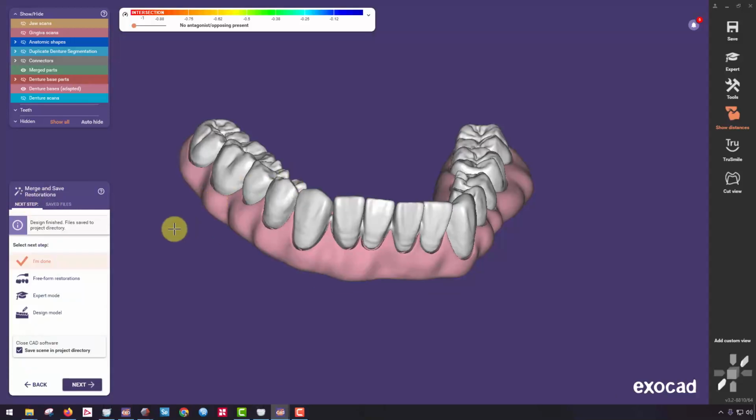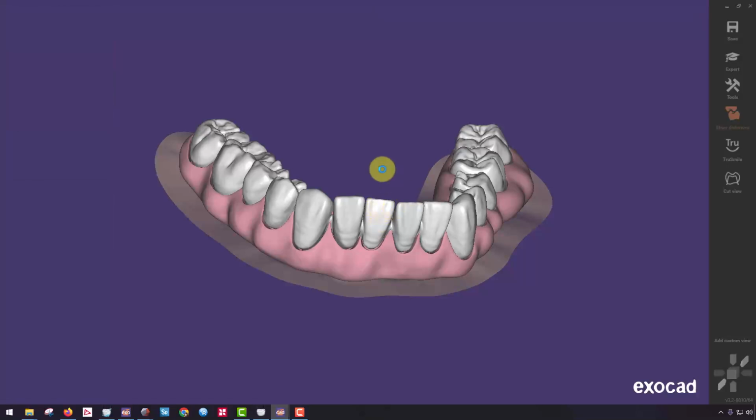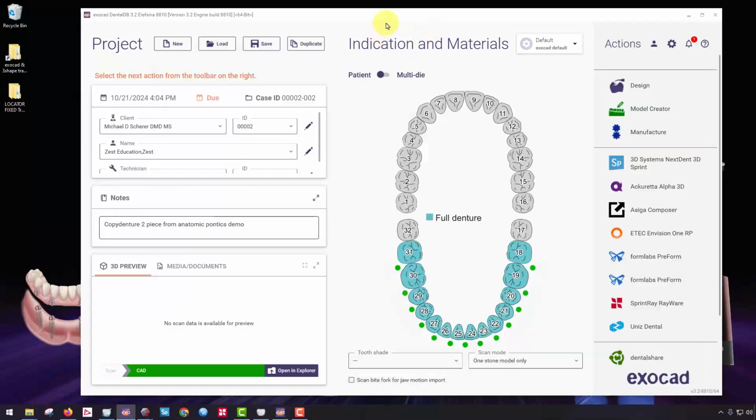Once you're done with the file, you can go ahead and click the I'm done function, or you can access your files at any point using that Saved Files, or if I click on next, it'll say I'm done. It'll save the scene with all the details right in here. And then you'll be able to notice once you come back to your database manager that you can access your files at any given point by clicking on Open and Explore. It'll open to that folder right there on your desktop or wherever it is in your computer.